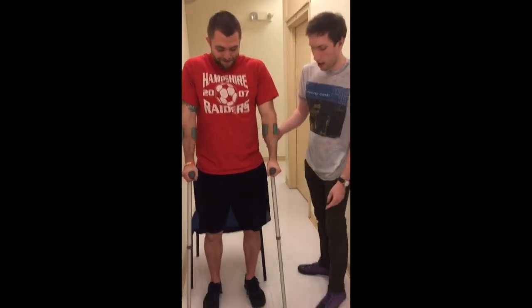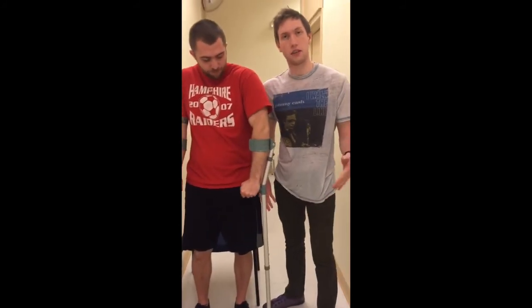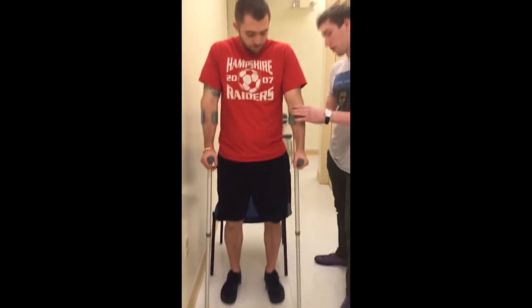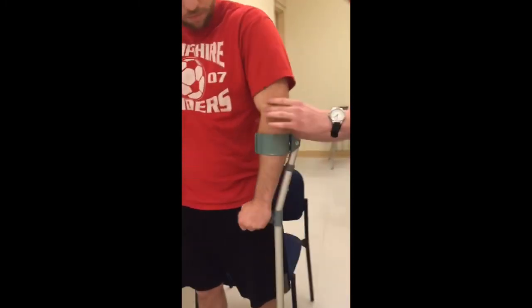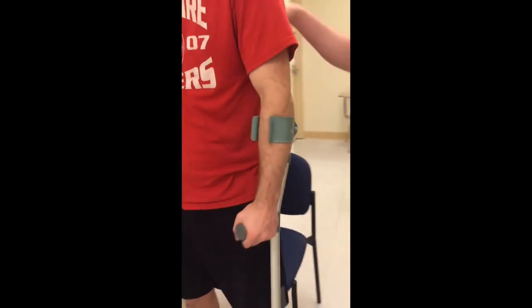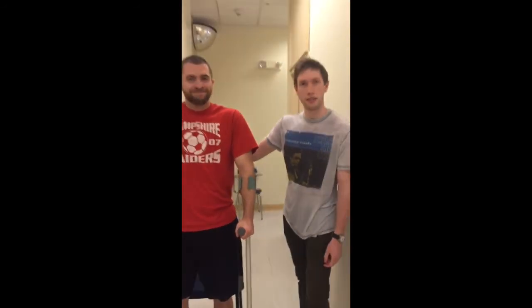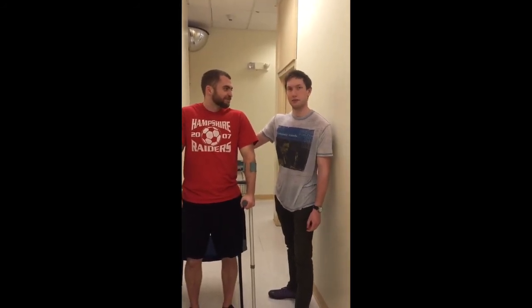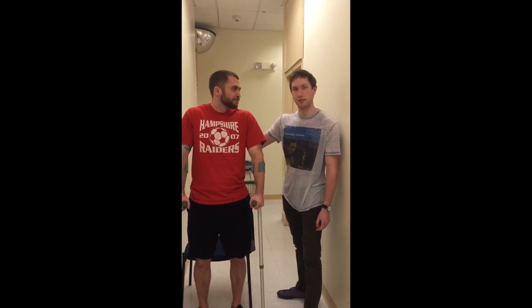Perfect. And again, similarly to the axillary crutches, we're looking to measure these when the base of each cane is at a 45-degree angle from the foot, okay, 6 inches away. All right? I'm looking at the olecranon again. I'm calling that pretty close. We have successfully and efficiently and in a pretty friendly way, I think, fit these crutches to Tim.